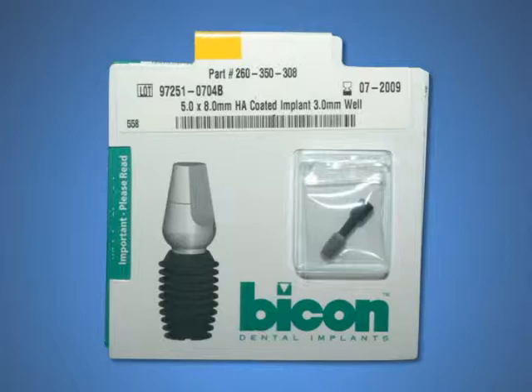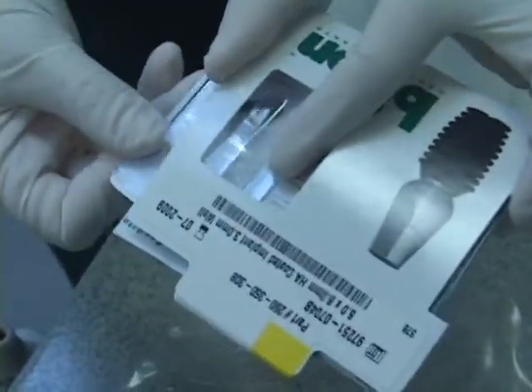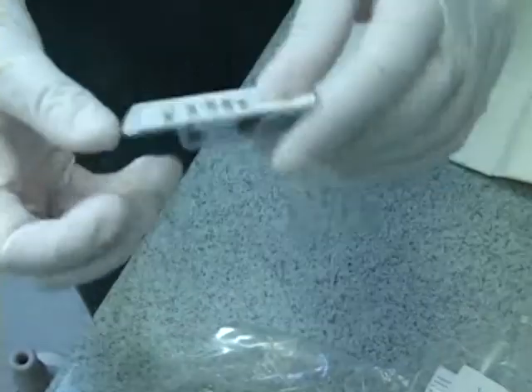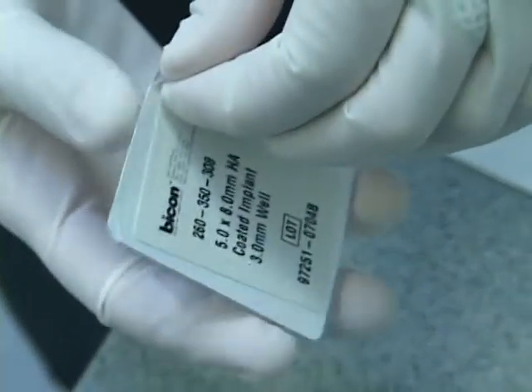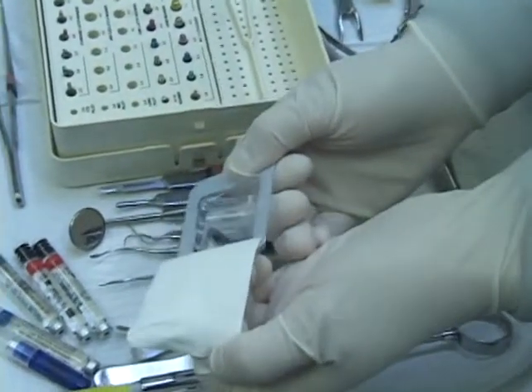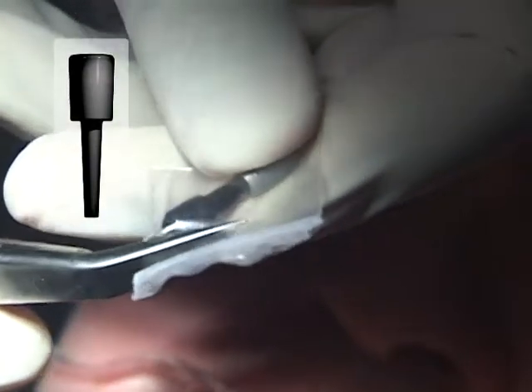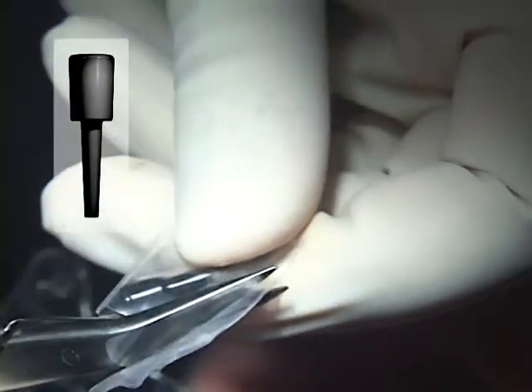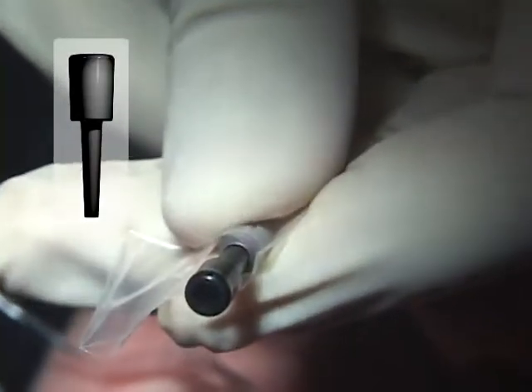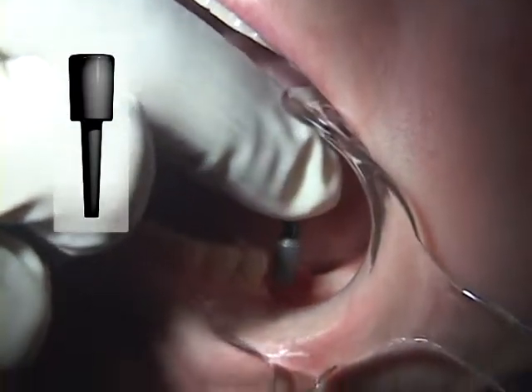The sterile blister package containing the selected implant is removed from its cardboard folder by the circulating assistant. The assistant then tears open the Tyvek backing on the blister package and carefully, without contaminating it, drops the sterile inner plastic bag containing the implant and the plastic healing plug inserter onto the sterile instrument tray. The scrubbed assistant or the dentist grasps the implant through the plastic bag and opens the sterile package with a pair of scissors. All implants are packaged with the healing plug inserter attached.